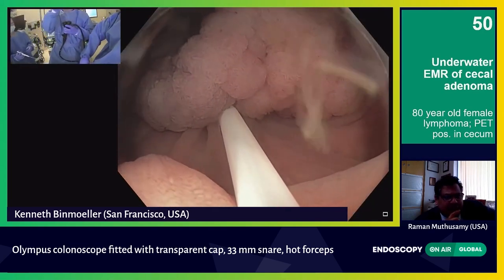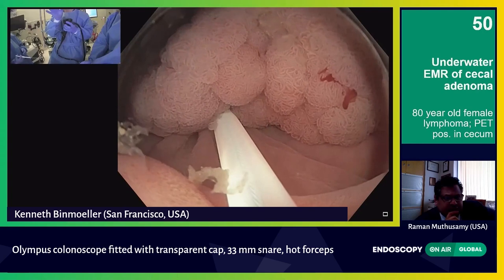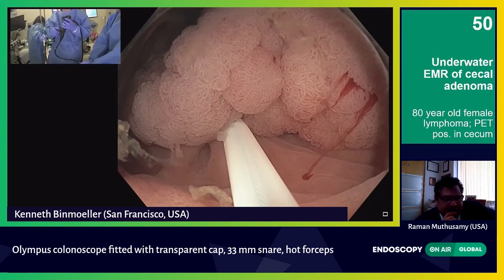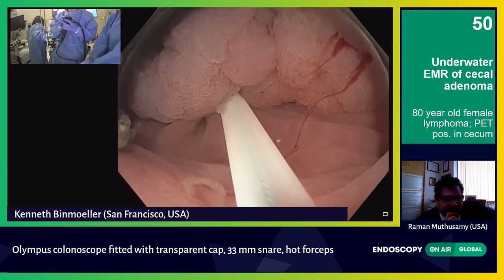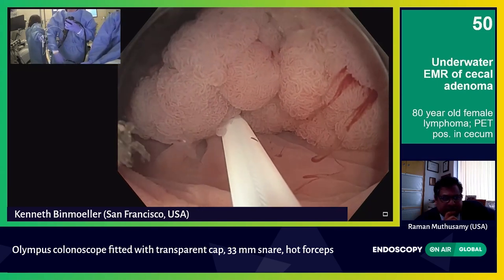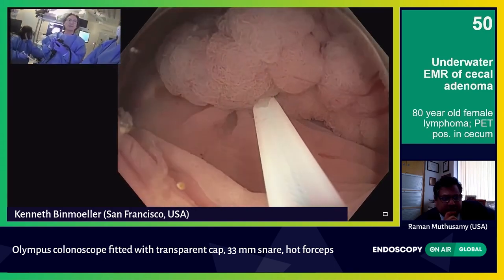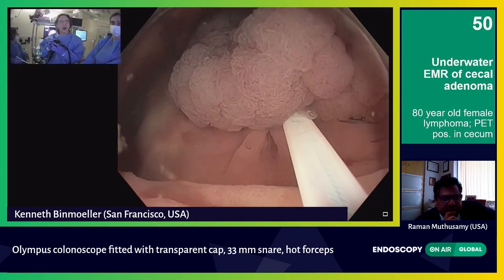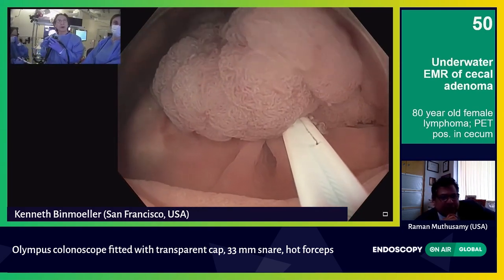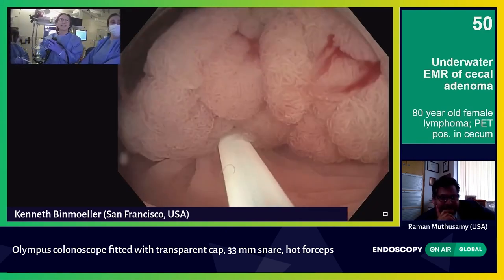This is where I see the advantage of the underwater technique — that I can get a higher en bloc resection rate. The literature is starting to validate that we're getting higher en bloc resection rates. And that, after all, is the weakness of EMR versus ESD — ESD promises en bloc more often. But if we can accomplish that with the EMR technique, then you really don't have that strong of an argument for ESD anymore.